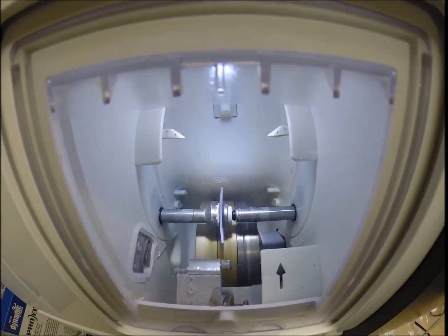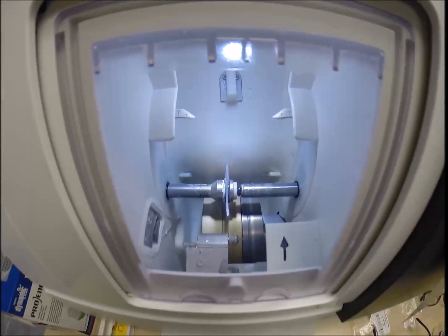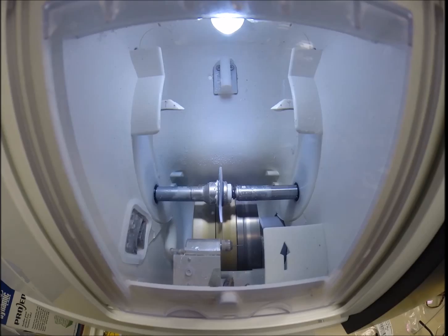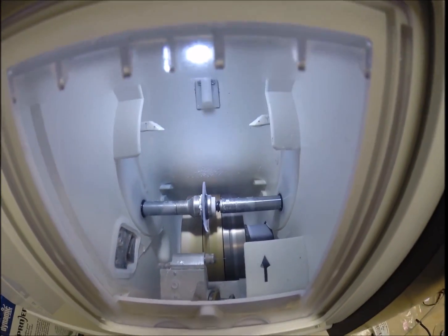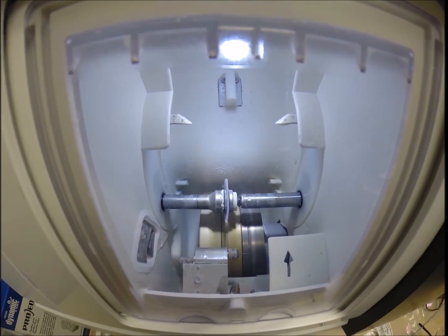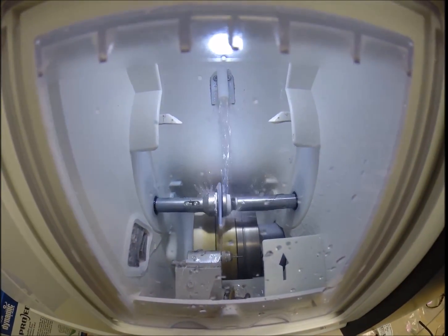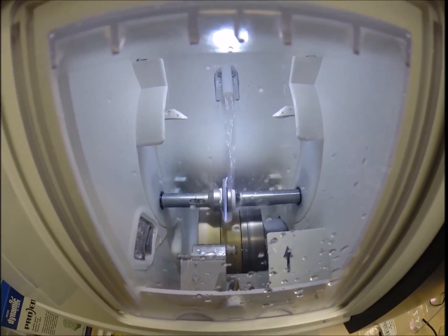So now your lens is getting the V-shaped bevel put onto the lens so it stays inside the bevel of the frame. Just a moment ago it was flat just like a nickel. I could take it out and it would stand up on the counter like a nickel would do, but now it's getting the knife-like edge. So water has begun spraying onto the lens, which tells me it's in the last 20 seconds of the cycle.